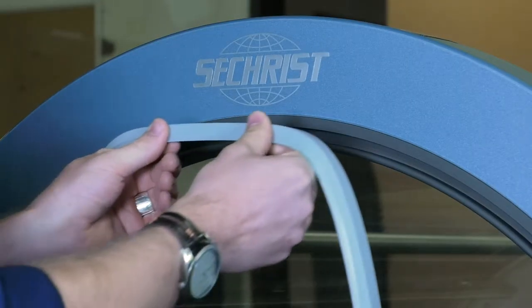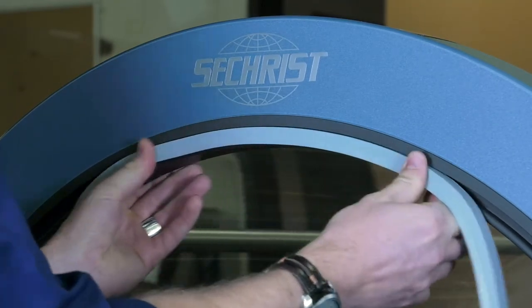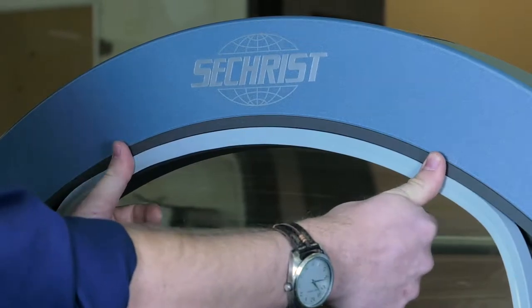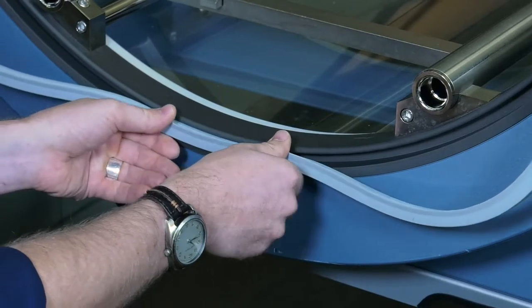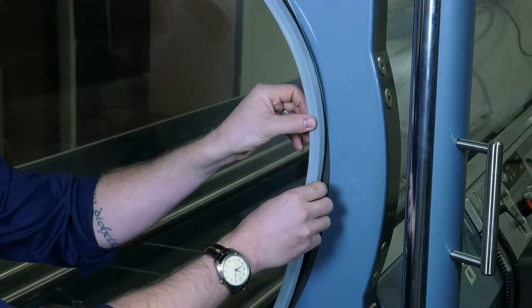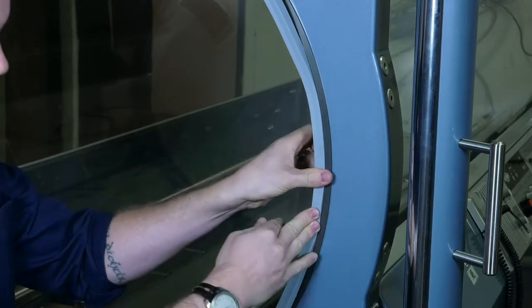You want to put your door seal in at the 12 o'clock position. Make sure the lip of the door seal is to the inside of the chamber. Push the seal in. Once you're in at the 12 o'clock position, move down to the 6 o'clock position, keeping the door seal evenly spaced. Push it in at the 6 o'clock position. Then move to the 3 o'clock position, trying to keep an even amount of seal on the top and the bottom. Push in at the 3 o'clock position.